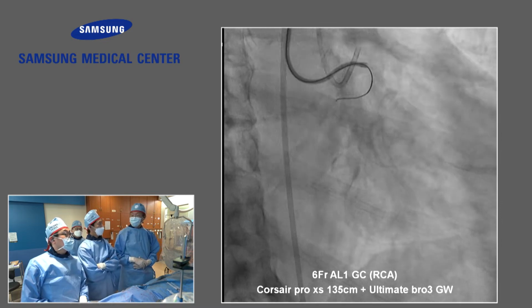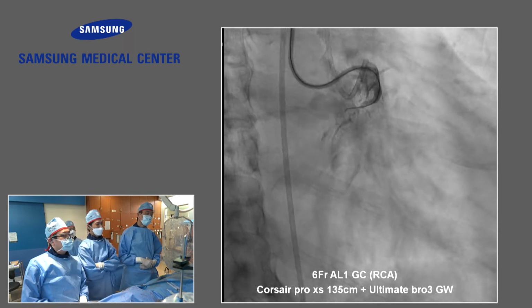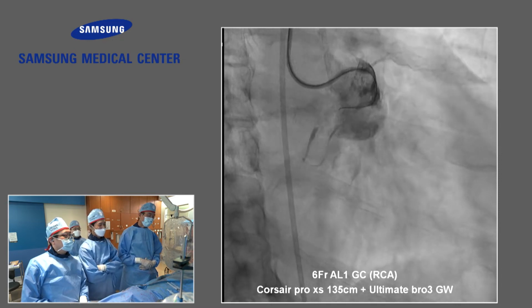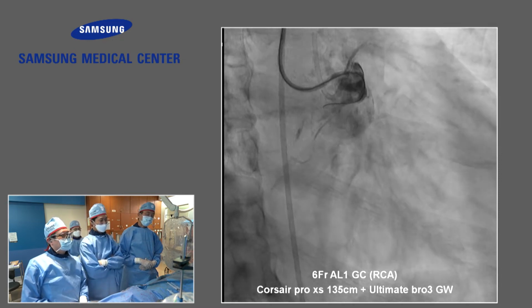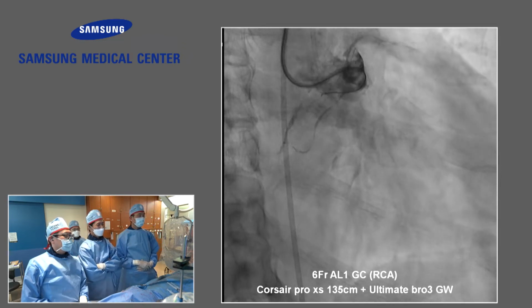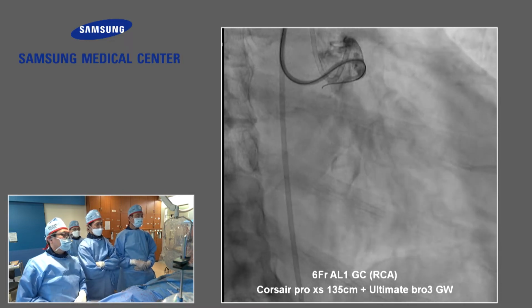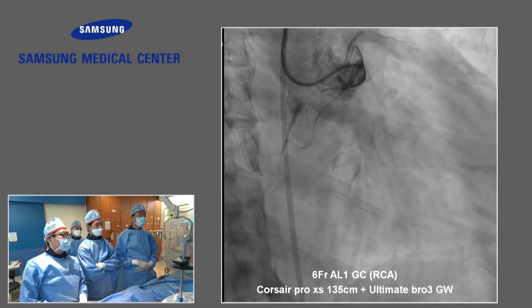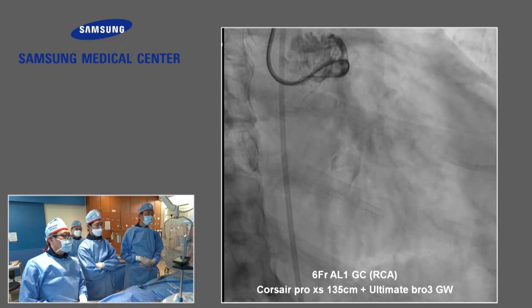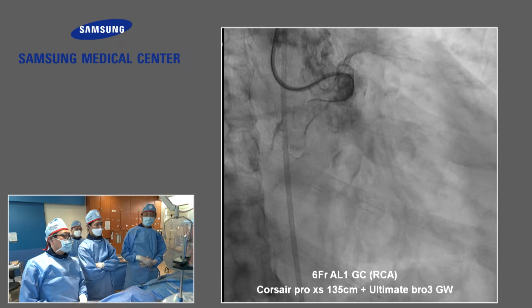Oh, I love that. Dr. Hyo Kim told me every time that I am very poor at selection of the guide wire, so I was depressed. And in this specific case, the proximal stump has two side branches. When you use Gaia, it is really difficult, because with UB3 you can manipulate the bending angle and penetrate in the center without side branches. Good choice. Yeah, thank you very much.